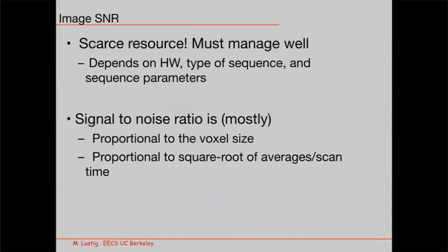Okay. So let's quickly talk about SNR. SNR is a scarce resource, and it must be managed very well. You've seen that when we looked at the situation where we set a certain resolution and then regretted that resolution afterwards, because we lost SNR by not setting our resolution appropriately. So SNR depends on hardware, the type of sequences and sequence parameters.